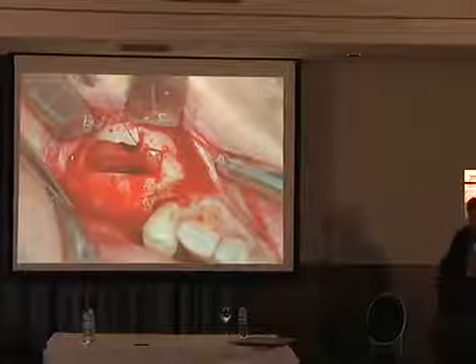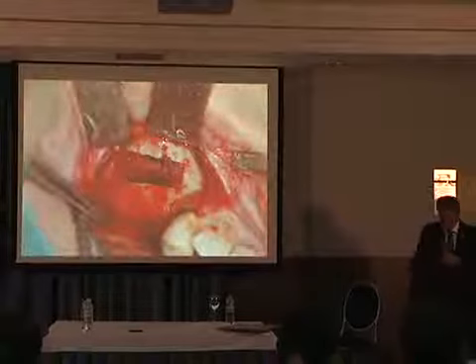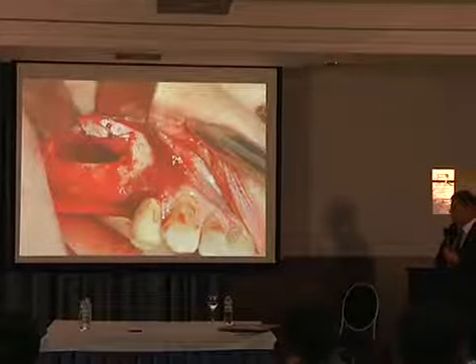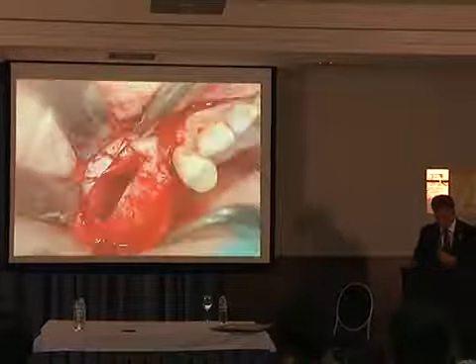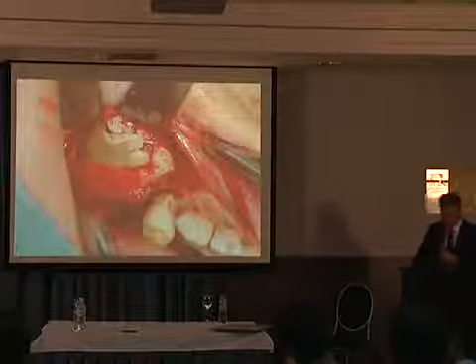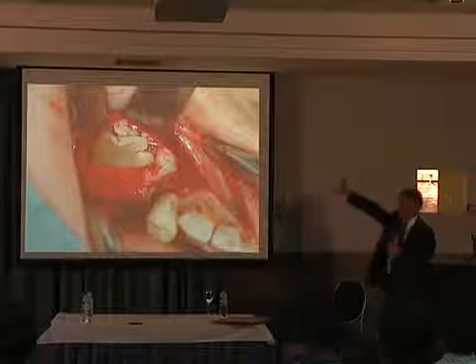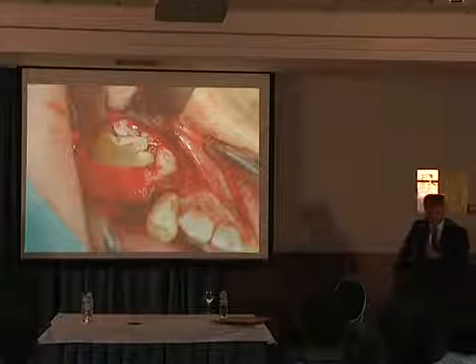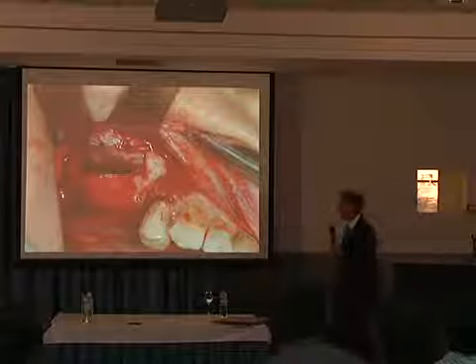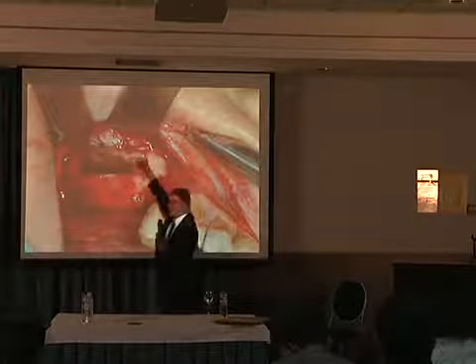Then stitch number 1. Drill the hole. Через отверстие. Stitch number 2. Второй шов. Story is gone so far. История закончилась, подшили мембрану. You can see now the perforation closed. Теперь видите, насколько вся эта была сделана препаровка. PRGF to reinforce the Schneiderian membrane. Опять же подкладывается вот это богатое факторами роста материал, для того, во-первых, он прилипнет опять к этой же мембране. Та же самая техника. That's great to see, huh?